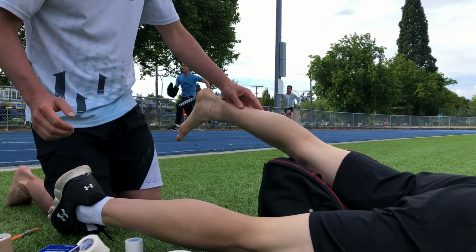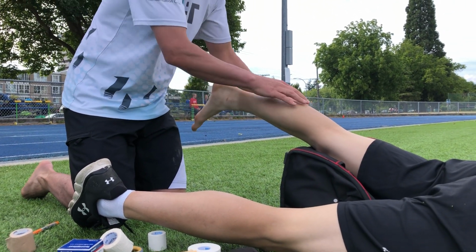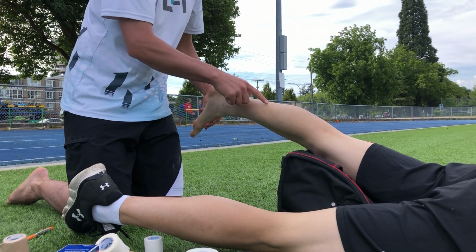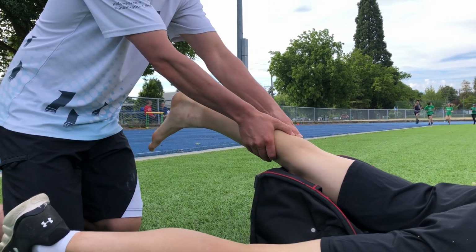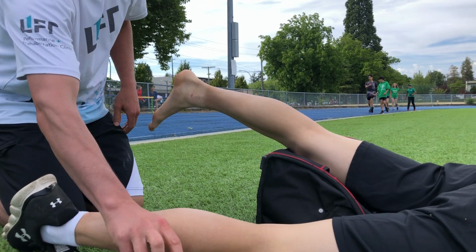So we're gonna do an Achilles tape job. We're in prone, so we have a good view of the whole calf here, and it's gonna help us to see the alignment coming down into the Achilles. We're going high, and we're gonna create a lot of anchoring down into the foot.